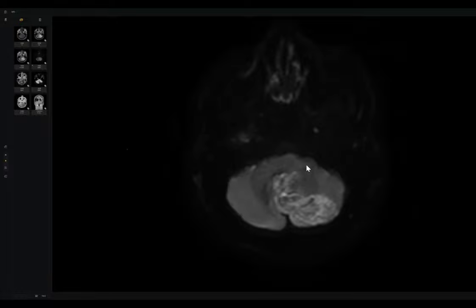Sir, I'm not sure. Maybe perfusion images. Yes. What is the parameter? What is the finding and its value? Oh, sir, I don't know. You know the penumbra, correct? Yes, sir. Talk about the penumbra. All of us, we don't know anything about the perfusion except the penumbra. So talk about it. Very easy, correct? Give me any information about the penumbra.